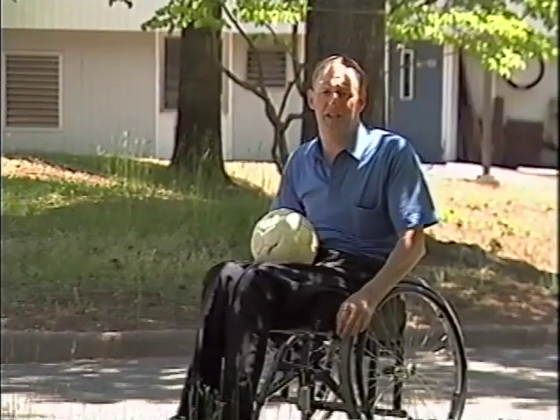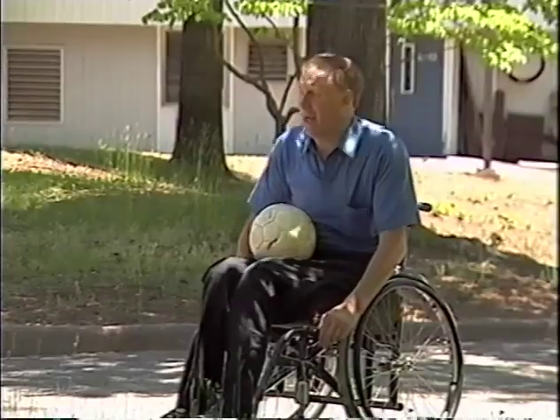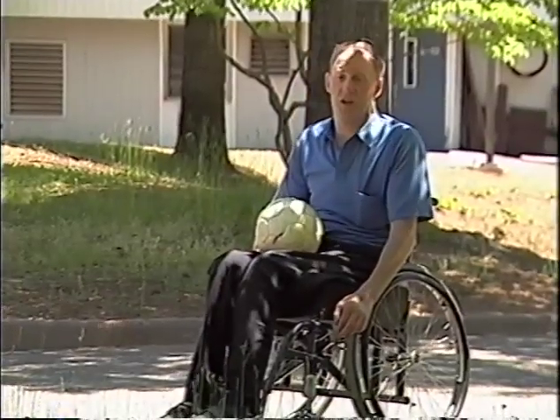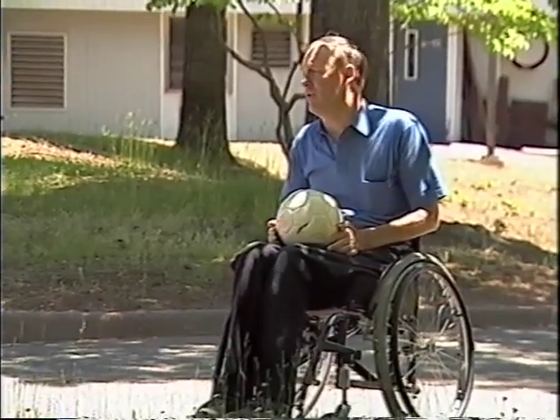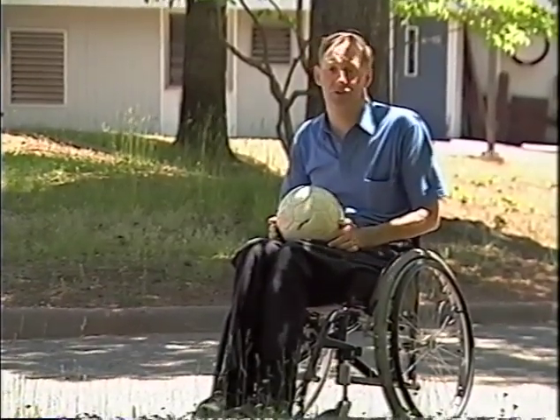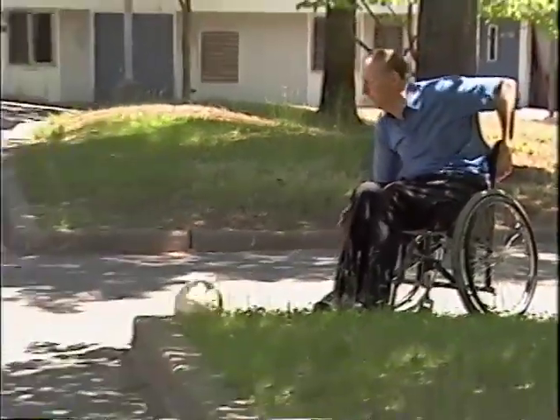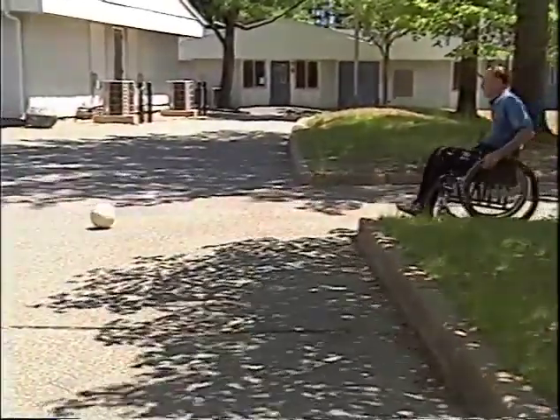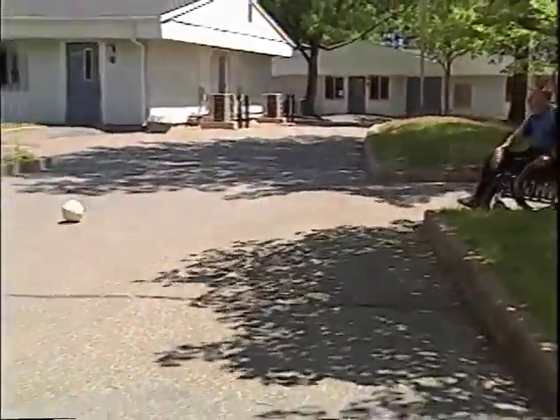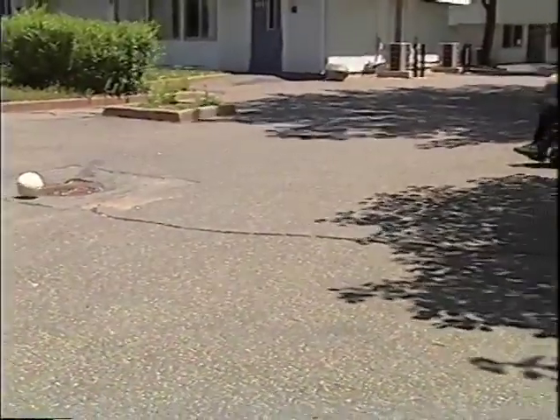When it comes to reading uneven surfaces, you have to make several decisions. Basically, how fast you want to go and where you want to go. The slower you move on an uneven surface, the more that surface will have an effect on your wheelchair. So if we go slow down this little hill, you can see that the low spot of the sewer is affecting the ball greatly.